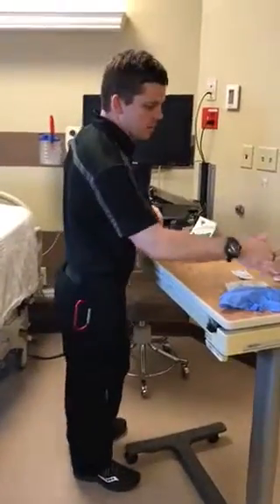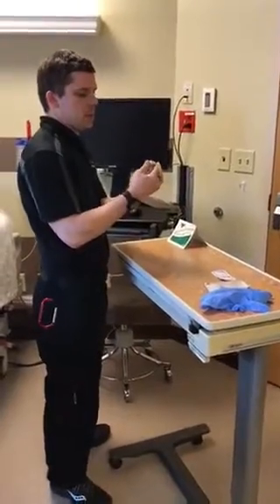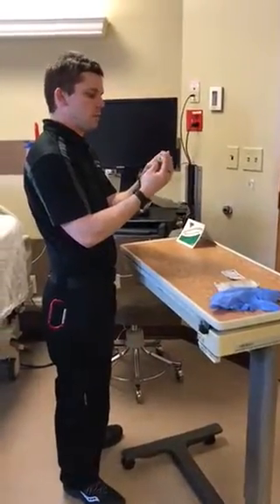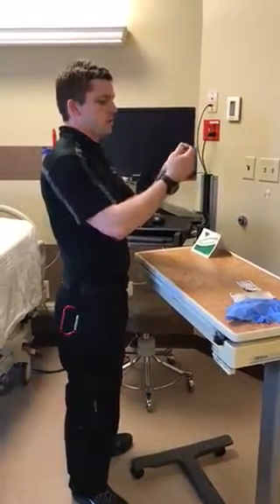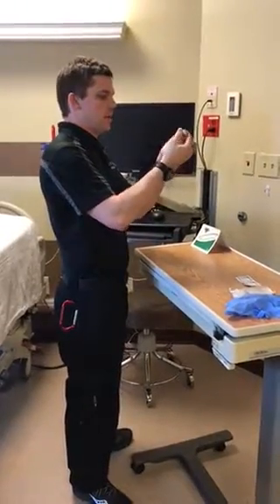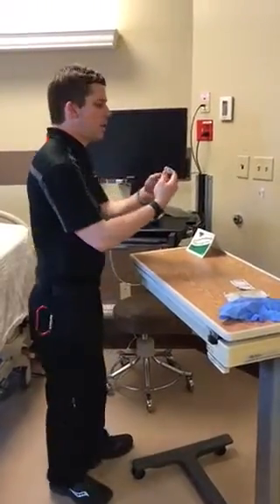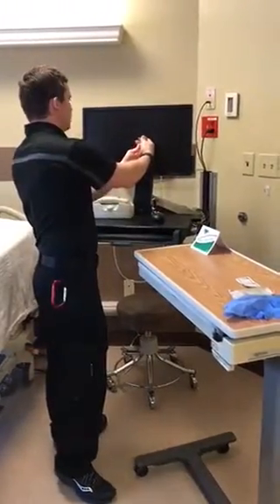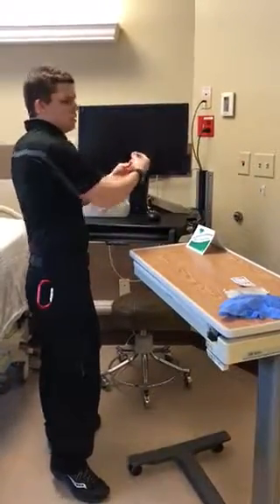And I'm going to go to my medication dispensary and type that in. I'm going to get it out. It's a multi-dose vial, so I'm going to double check it was initialed and the date was open today. I'm going to check it for cracks and particulates and check the date on it, which is 04 of 2027. And I'm going to check that against the MAR to make sure that it is in fact the correct drug, and I'll be withdrawing 0.5 milliliters.